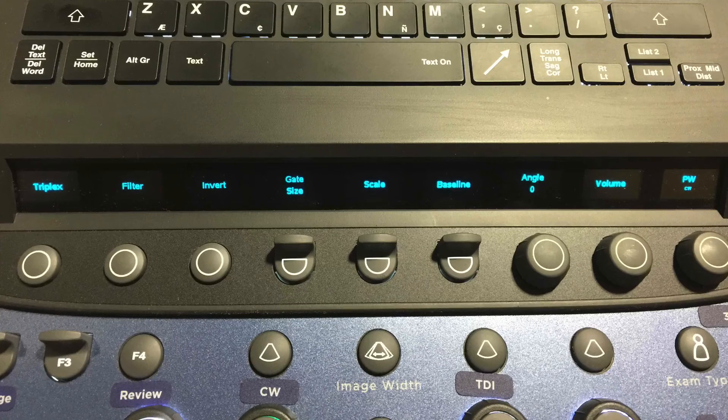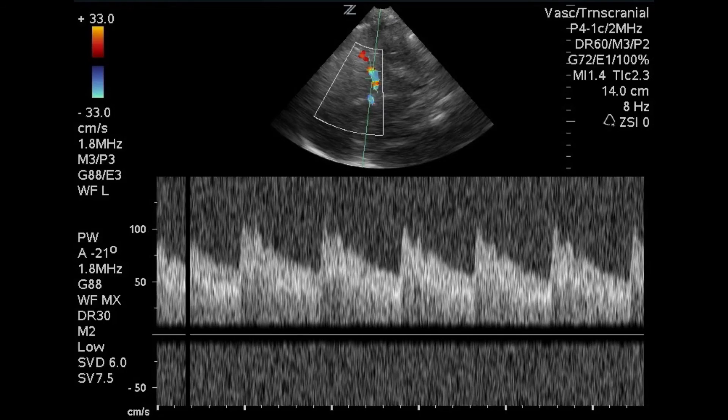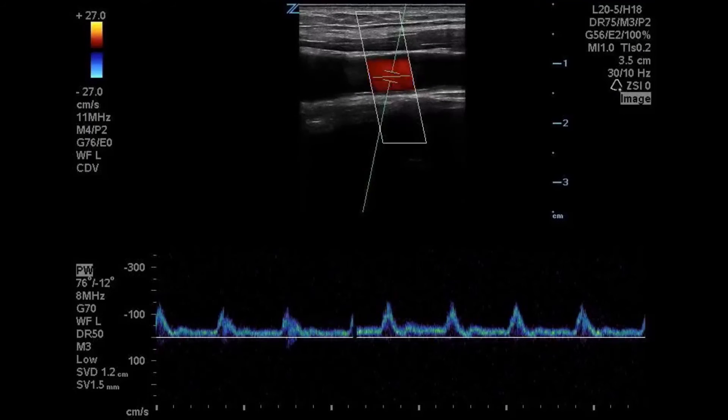The soft keys will allow you to activate triplex, change your filters, invert the scale, change your gate size, scale, and angle, and other items related to spectral Doppler — including changing between pulse wave and continuous wave Doppler. You can see in the sample we have a spectral Doppler tracing with an image at the top showing our color and B mode.